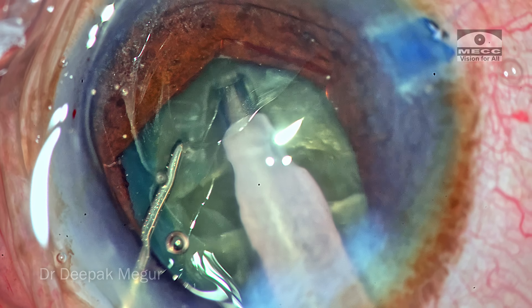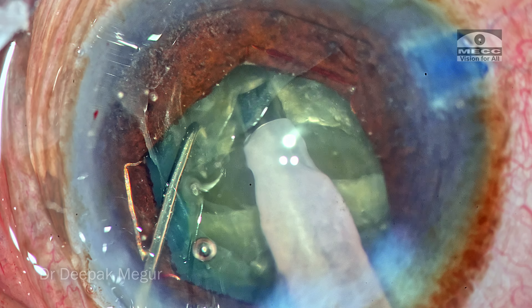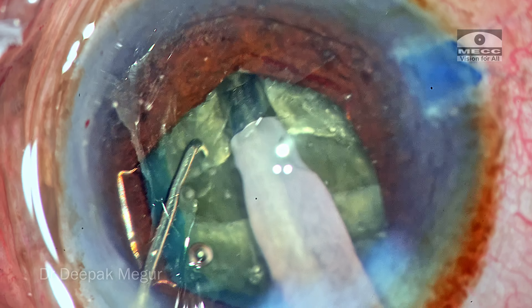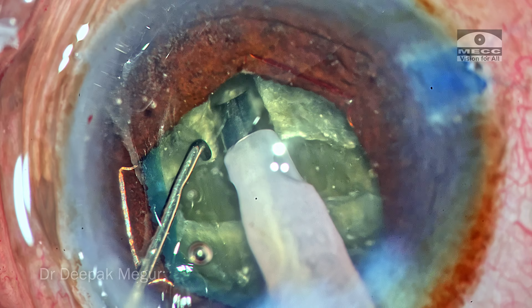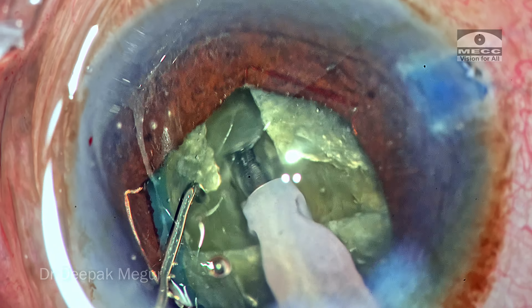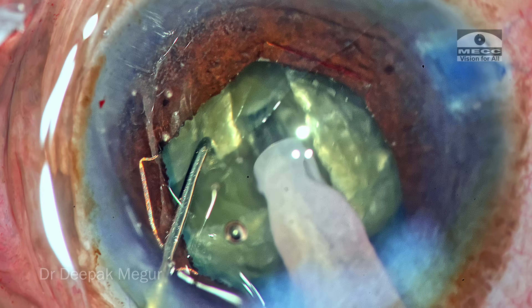A common misconception is that sculpting will induce or worsen zonular weakness. I can demonstrate that as I sculpt, there is hardly any force imposed on the nucleus and bag. The left-hand instrument stabilizes the nucleus while the energy melts the nucleus in front of it. There is hardly any evidence of stress on the capsular bag or zonules. It is technique that we need to master. Modern machines also have the ability to cut very effectively without generating much heat energy — a distinct advantage.